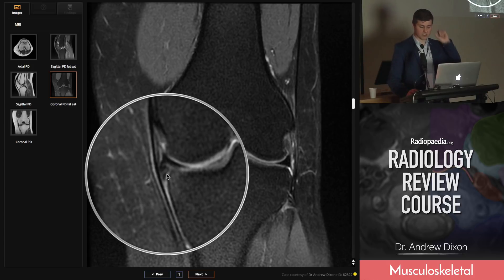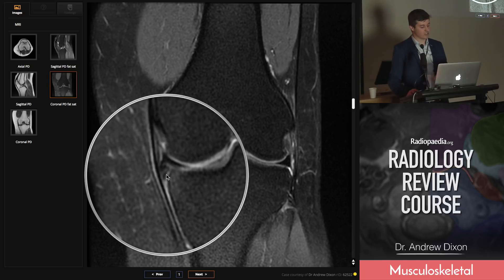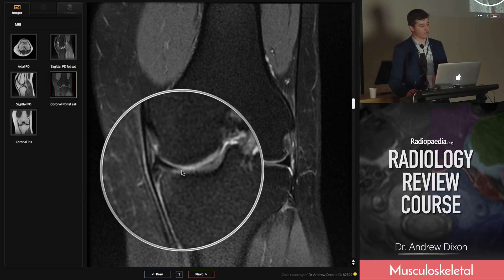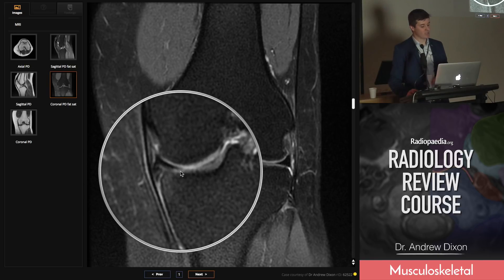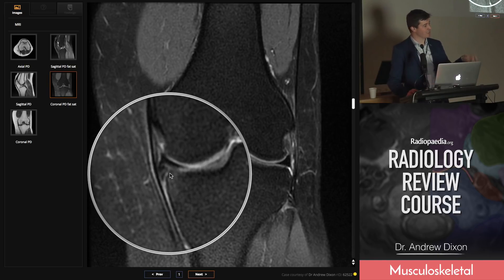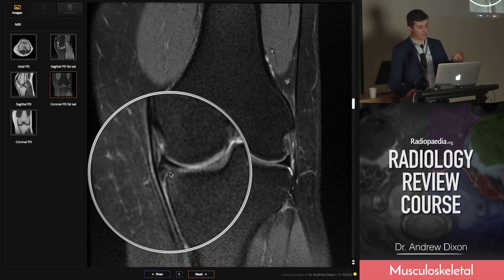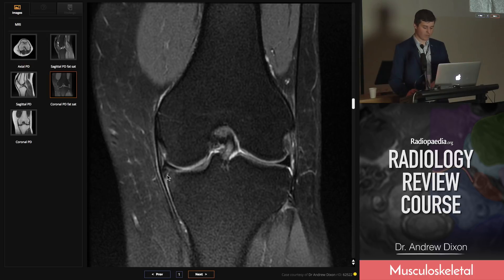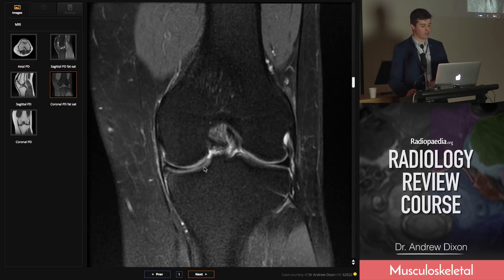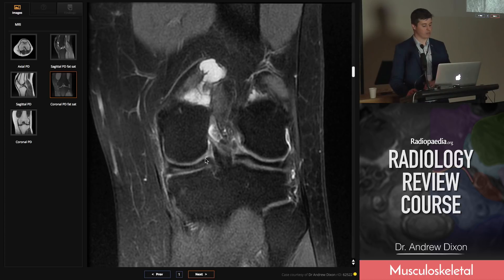It's important because the surgeon won't know to stick their probe down there and pull that bit out — it just looks like a nice inner free edge to them. You need to specifically state there is a small horizontal flap tear displaced into the tibial recess. These flaps can flip upward or downward, and often they flip above the posterior root attachment — a little horizontal tear at the back flips up and sits there.